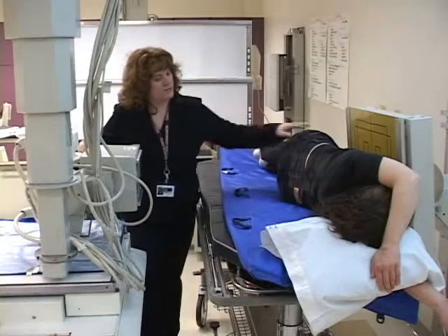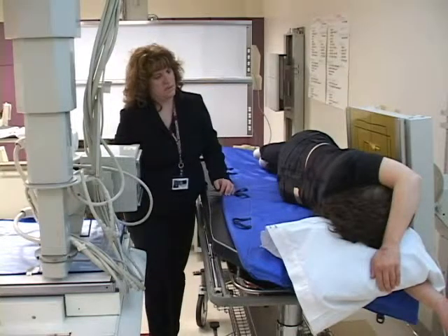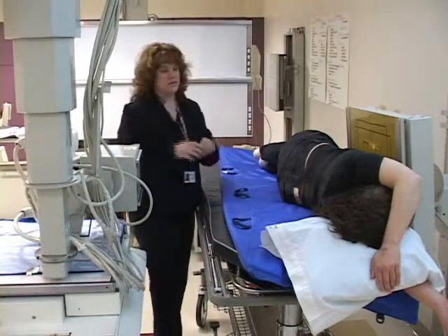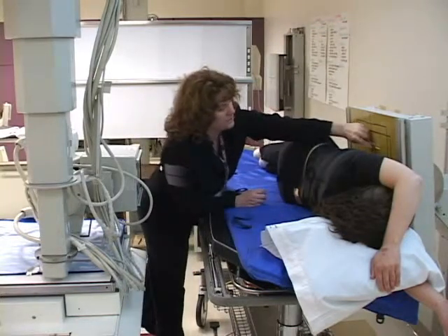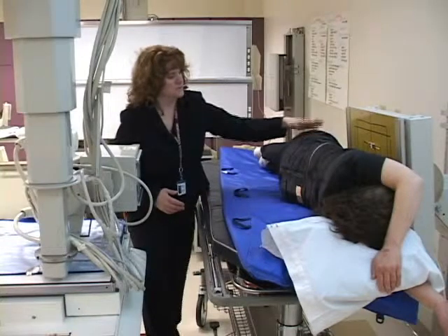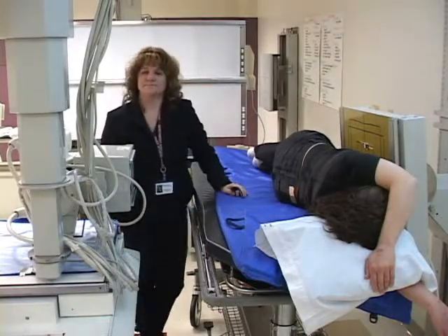Okay. I'm going to open up my collimation so I have a little bit of light right over the top. My cassette, or my IR, is actually going to be in crosswise. I am going to mark the upside. So this is her left side, so I'm going to put a left marker right here at her left side. Okay. I'm right at the level of the iliac crest. My wall bucky and my tube are lined up, she's lined up, and that's how I would take a decubitus abdomen.